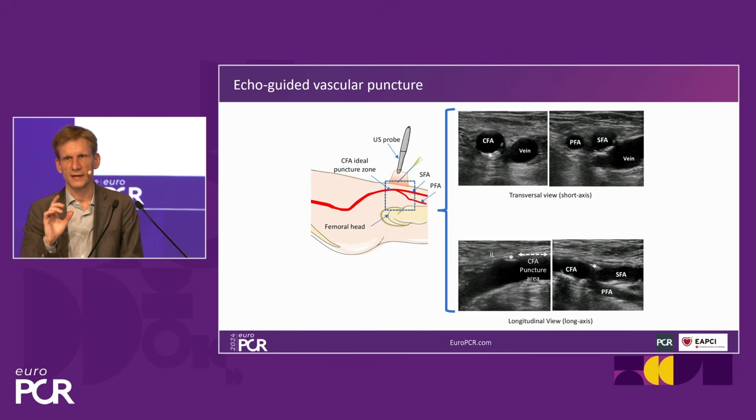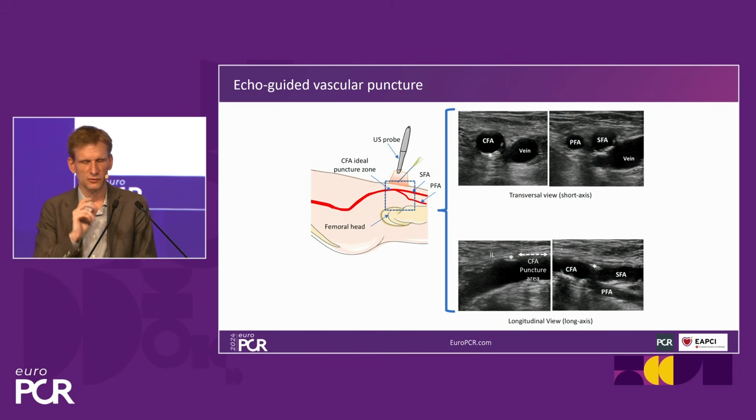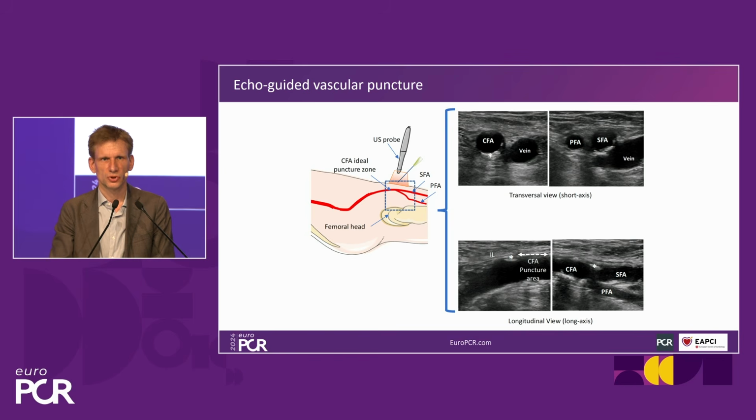Then if we look at the echo, and I think this is contemporary practice again, we should be using echo. I think it's not contemporary anymore to do just a fluoro-guided or even worse, a blind puncture. I think we really have to use echo there. So you have to get familiar with that, how to see your common femoral artery, your vein.